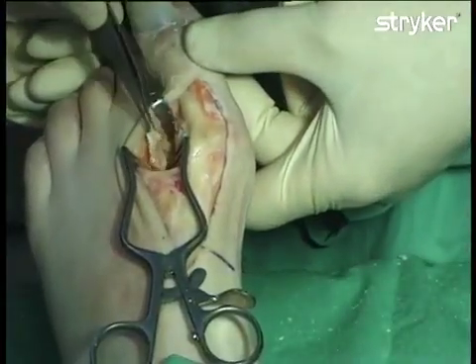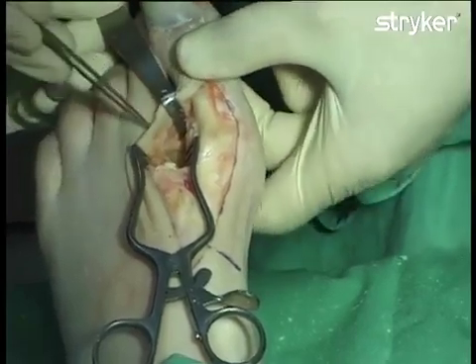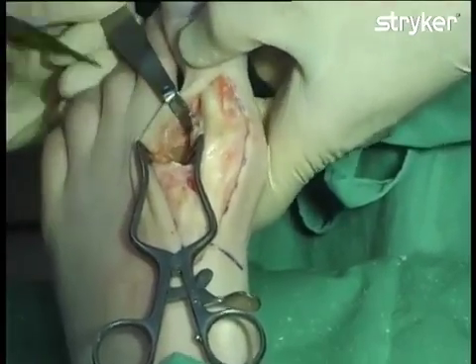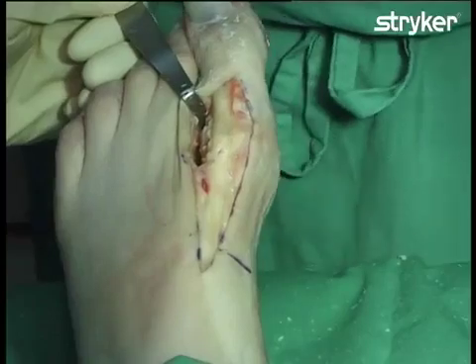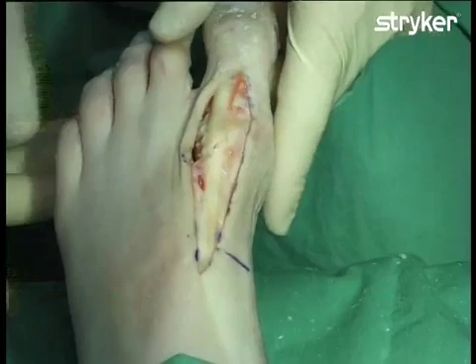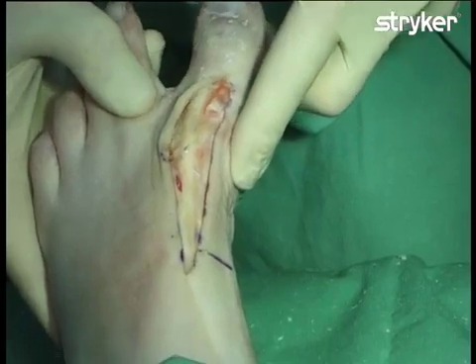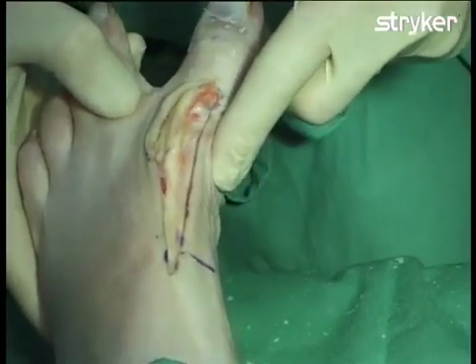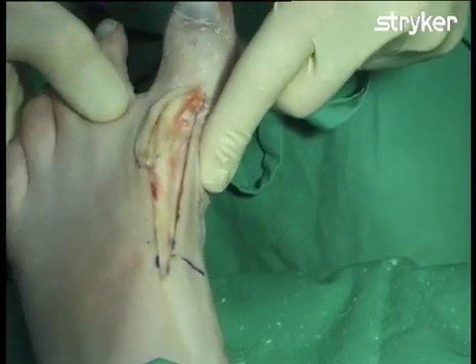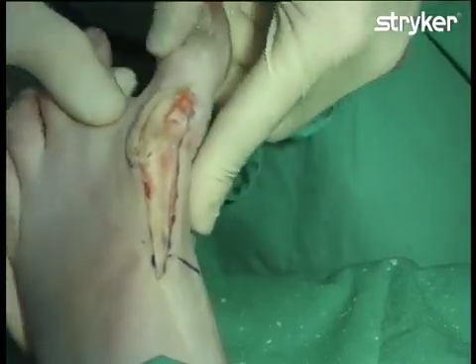Now that the full lateral release has been performed, the tendon has been transected, the sesamoids have been freed, and the lateral capsule for the first metatarsal phalangeal joint has been incised. The first metatarsal phalangeal joint can now be easily placed into varus. If it is not possible to manipulate the joint into varus, it will be necessary to look for additional soft tissue structures preventing varus angulation of the big toe.